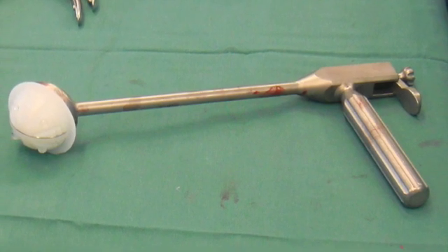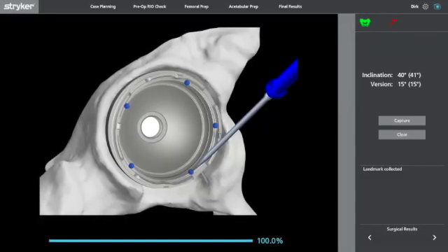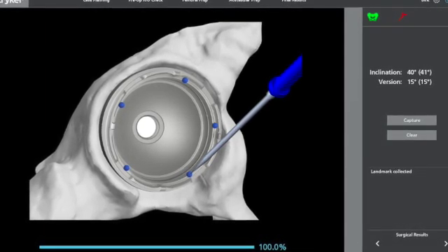Following this, the cup is cemented with your normal surgical technique. With the acetabular component in place, but before the cement sets, run the blue probe around the rim of the acetabular component, taking five points of registration, and this will give you feedback into the acetabular inclination and version.